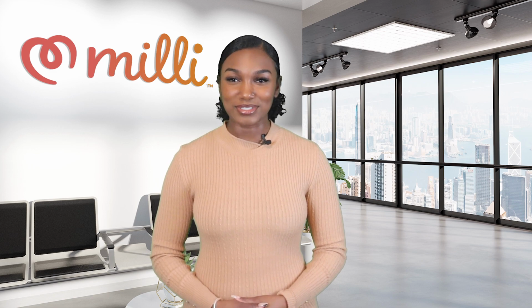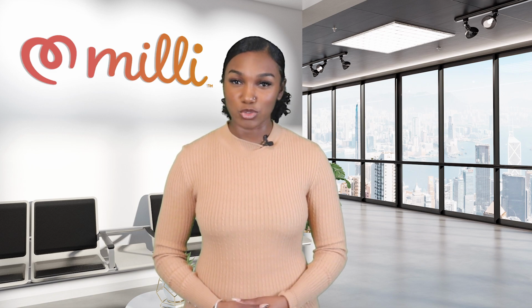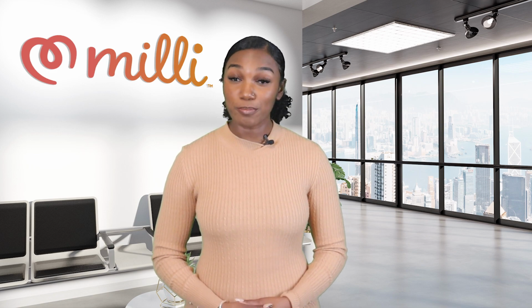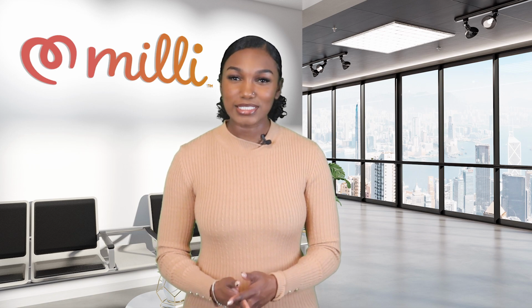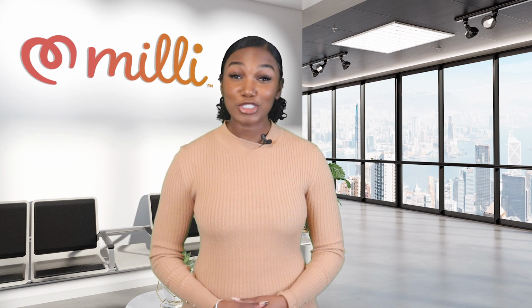The Milli Vaginal Dilator is usually used for 5 to 20 minutes several times a week. It is recommended that a water-based lubricant be used to make insertion more comfortable. When you first start using your Milli, begin with the smallest setting. The display should read 0, and when you feel comfortable, gently insert the wand into your vagina with the tip pointed slightly towards your tailbone.